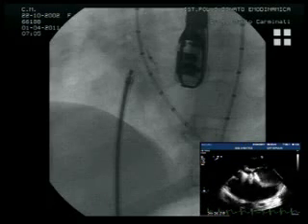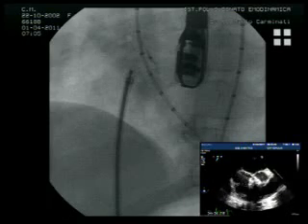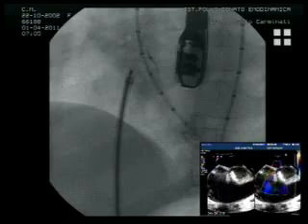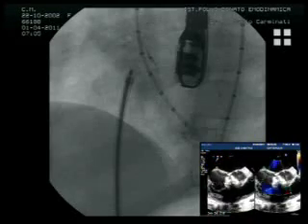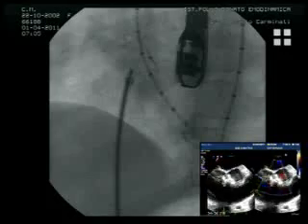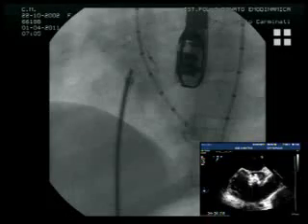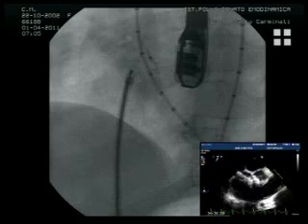Is the right umbrella still in the defect, or do you have any control on this? I don't think there's a lot of control, but maybe it's something we should be working at, that we make sure the device slips under the tricuspid rather than over. Check the aortic regurgitation. But I think you can see from the short axis view that we're under.